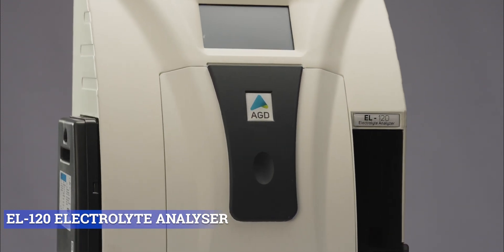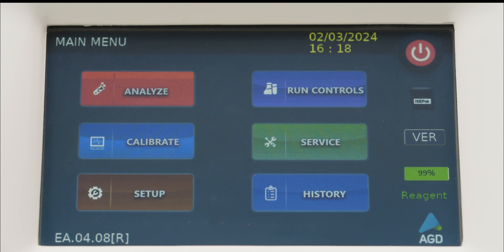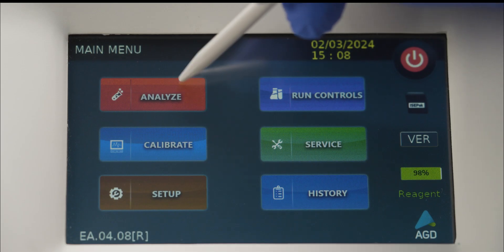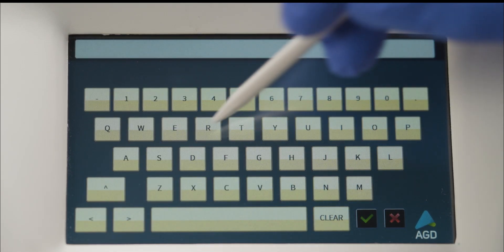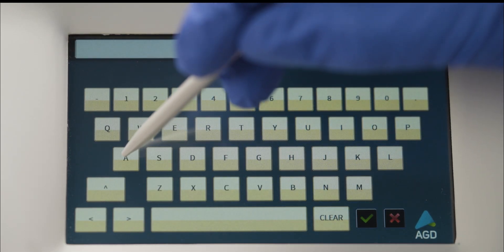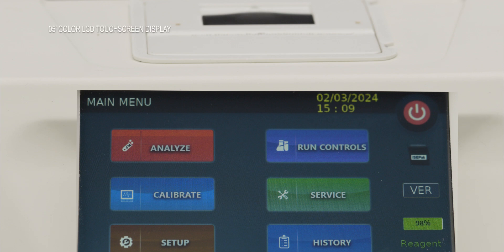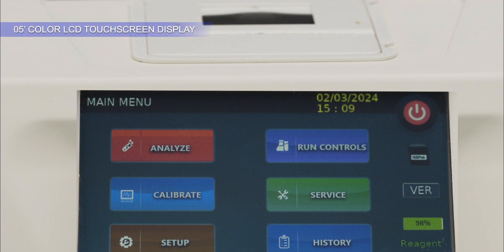Our electrolyte analyzer focuses on being user-friendly, making it easy to operate the device using the 5-inch color LCD touchscreen display for operators of all levels of experience.